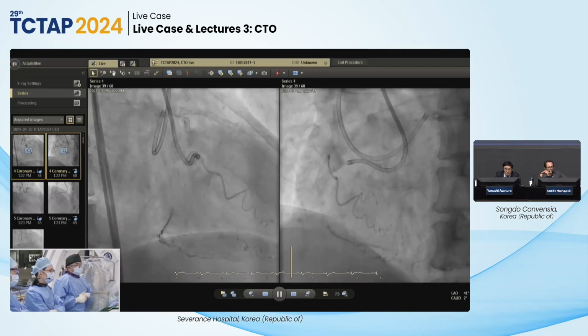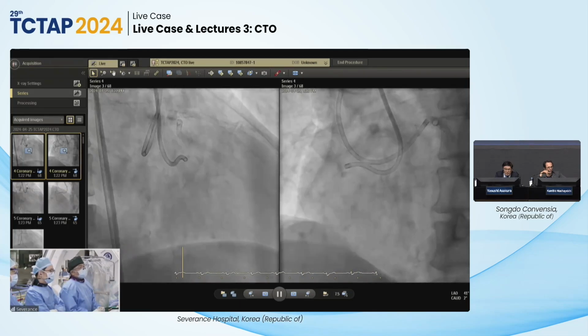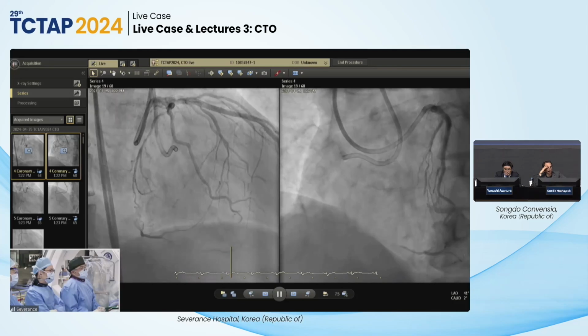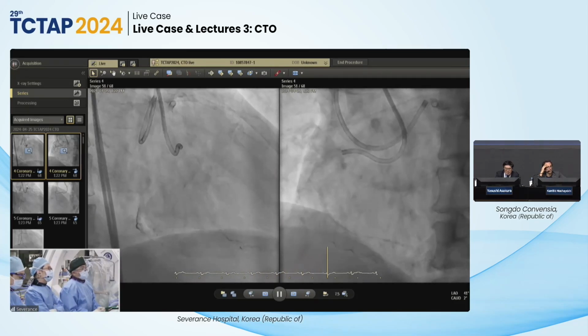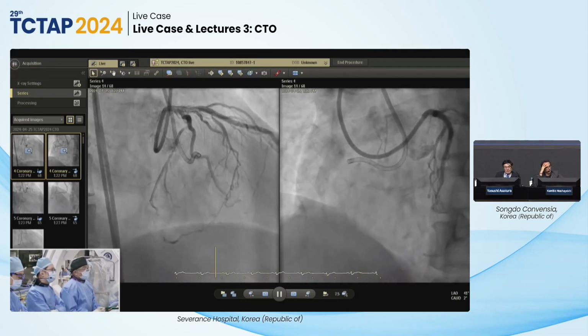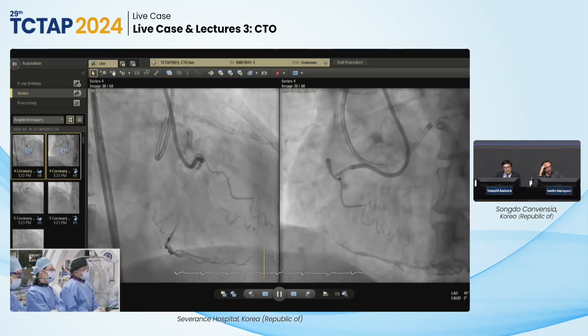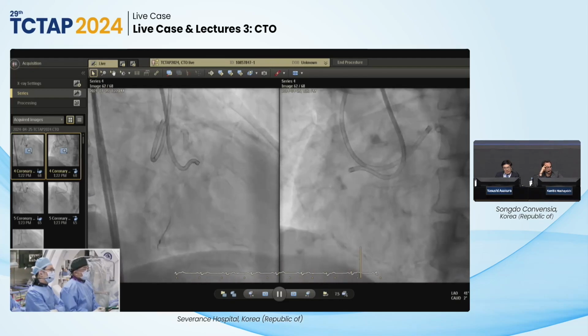Today, looking at the angiogram, originally I had a plan to do the antegrade. Well, what I think is, as I know, you do almost all cases with IVUS. What's going on in the proximal LAD? Is there a little bit more stent compression? Is this a late recoil there, or does the stent look a little bit dog-boned?